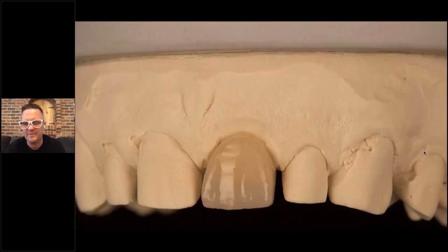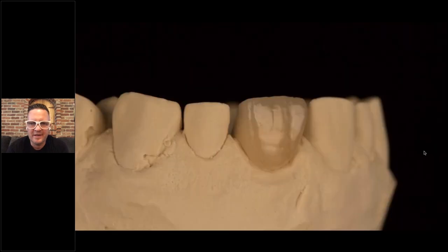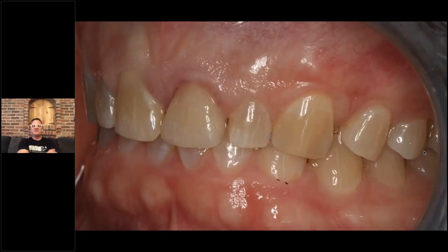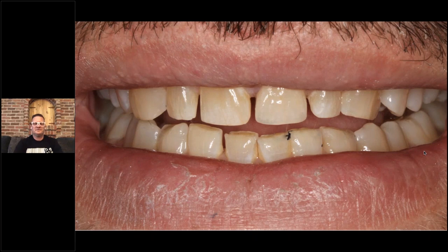So you might be thinking, how am I going to match this tooth? But again, just a couple of lab photos here. And this was the day of seating, so you could see the gum is irritated there, but we were able to, just with the spectrum stains and the luster paste, match what this patient has. I think that's a pretty good match for what he had. Of course, he wanted to keep the diastema and all that stuff. So for what it is, it's just such a great material to work with, to be honest.